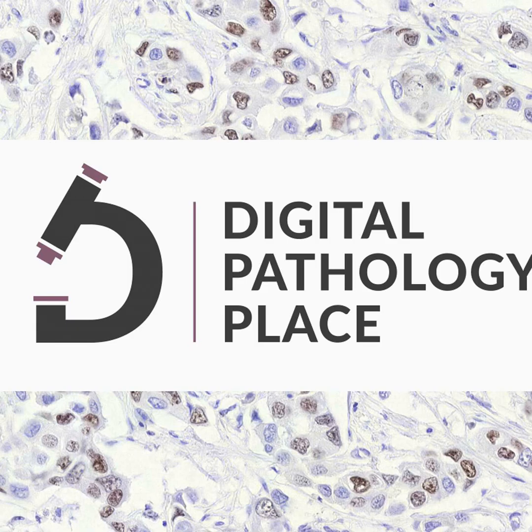We call the team where we do the analysis the image data science team, because for many people, the image analysis part is getting all the cells, but it's not stopping there. You then also have to decide which ones are the good cells, then define the biologically relevant phenotypes, and then make sense of this data. Because on the image, we have millions of cells, but depending on the size of your trial, you have a way lower patient number, which means the subsequent data mining is of a different dimensionality and should also be treated differently. So the question is, how can we extract from these millions of cells the best possible information.